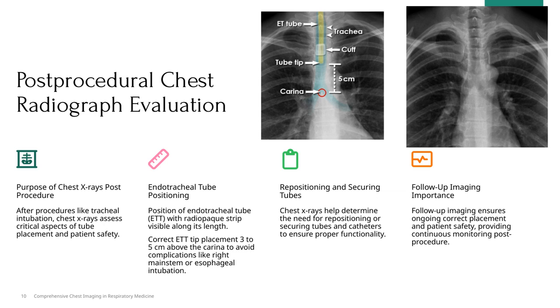It's a quick but essential check to prevent complications and ensure proper ventilation. Sometimes, the tube might need to be repositioned or secured more effectively. The X-ray helps us determine if adjustments are necessary to keep everything in the optimal place.